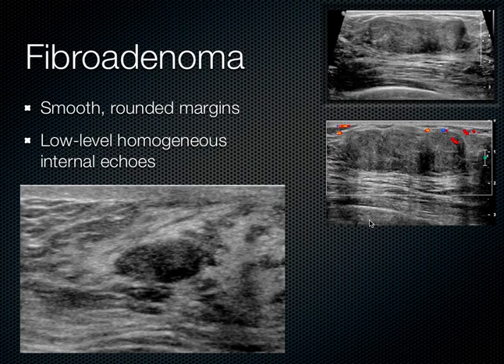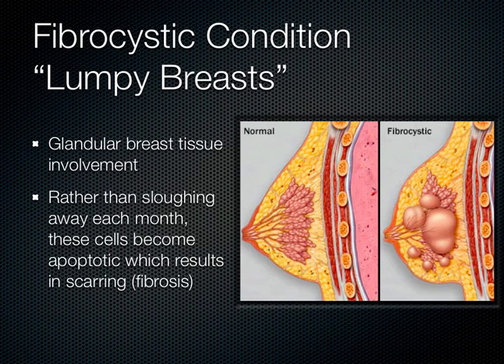To really differentiate these from something malignant, you really need to do a core biopsy of these structures. And again, as I mentioned earlier, ultrasound can help guide the needle right to the main part of these masses to help have a successful biopsy.